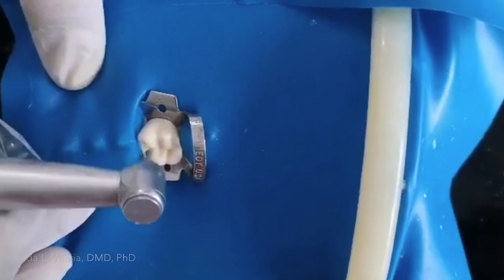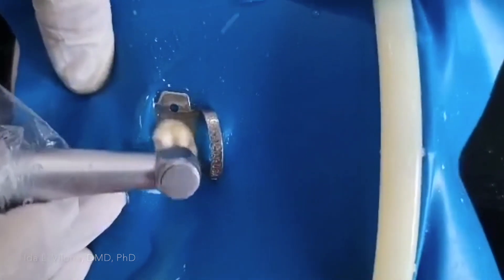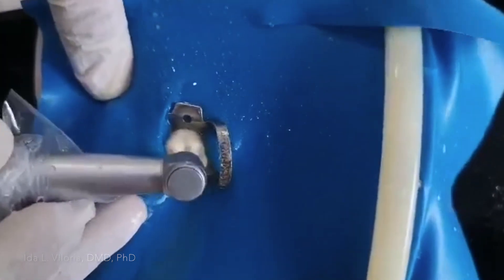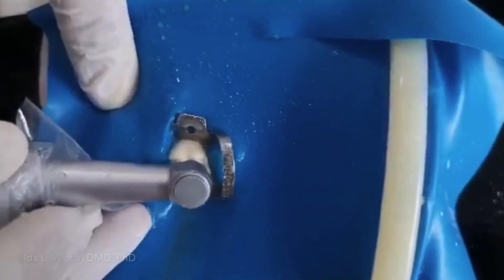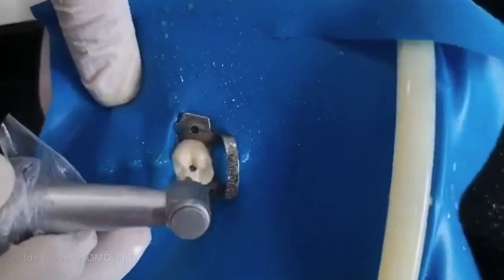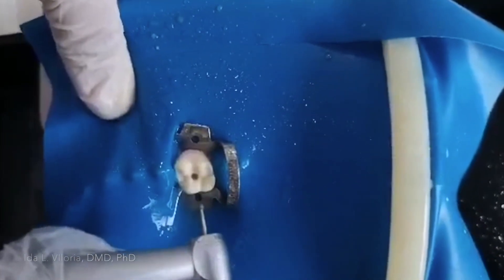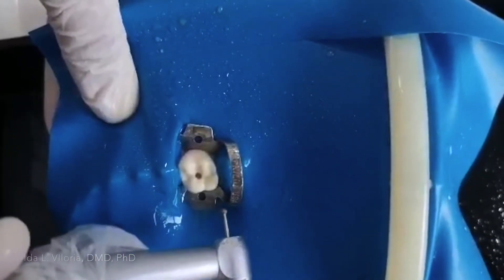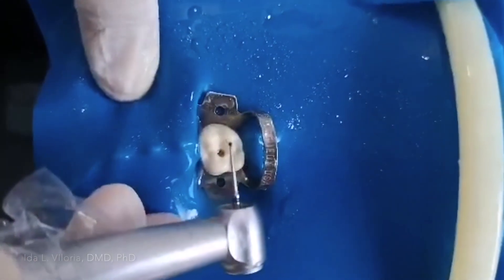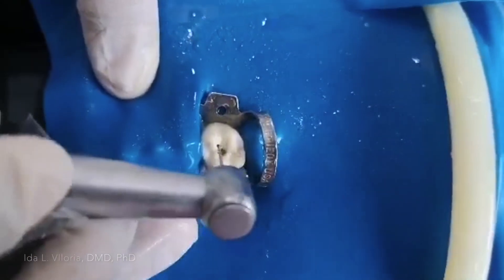I'll start at the center. When I have penetrated about three millimeters, I'm going to change my round burr into a small one, and it should be a long shank to be able to feel the drop. Now I have changed the round burr into a long shank small round burr.